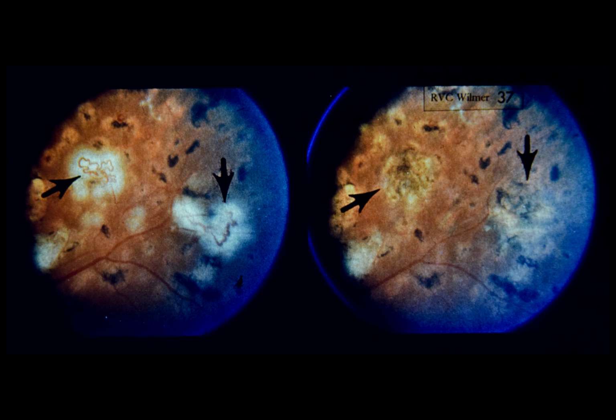Comment: in the treatment of retinal neovascularization with argon laser photocoagulation, it is important to achieve fragmentation of the vessels at the time of treatment. If one fails to achieve fragmentation at the time of treatment, it is almost certain that the vessels will not close later.